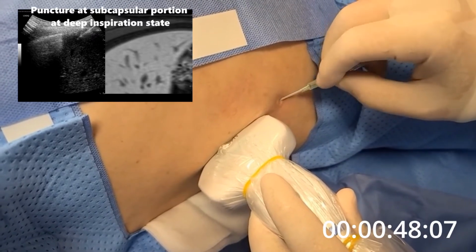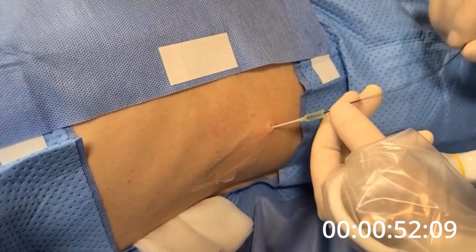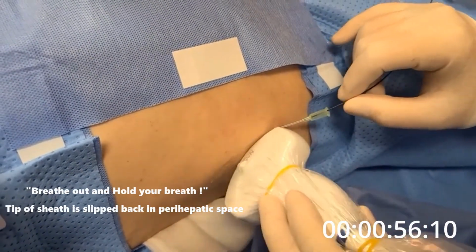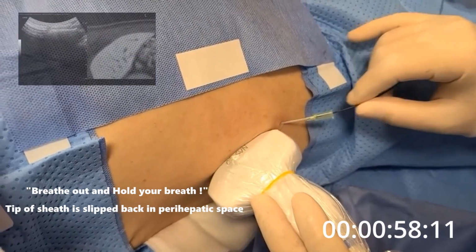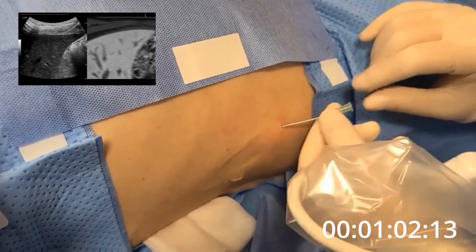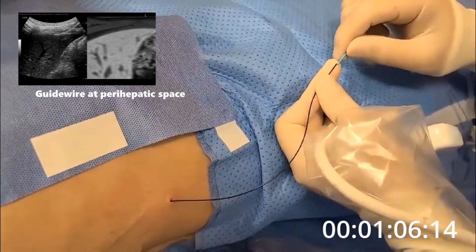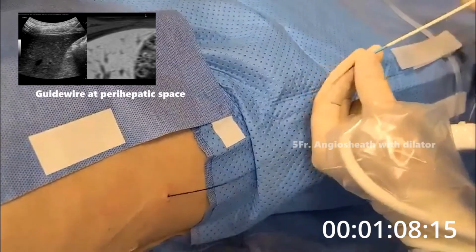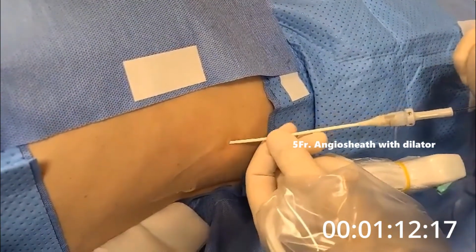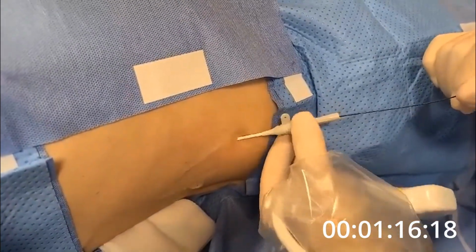After removing the stylet, I instruct the patient to breathe out and hold her breath. Usually the tip of the sheath slips back into the peritoneal space. You can see the guide wire at the perihepatic space. And I change it to a 5 French angio sheath with dilator over the guide wire.